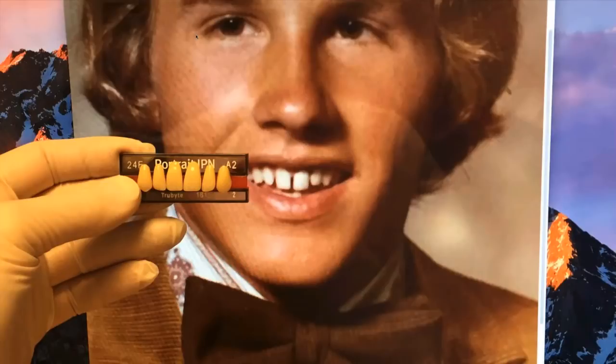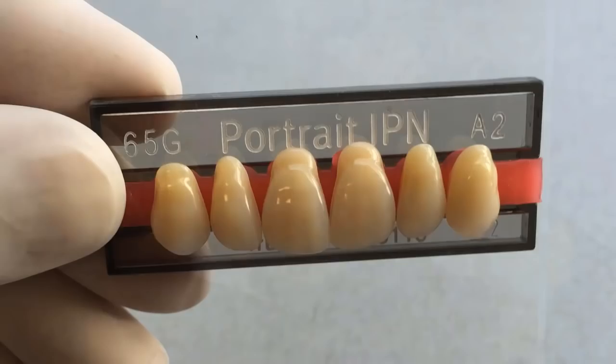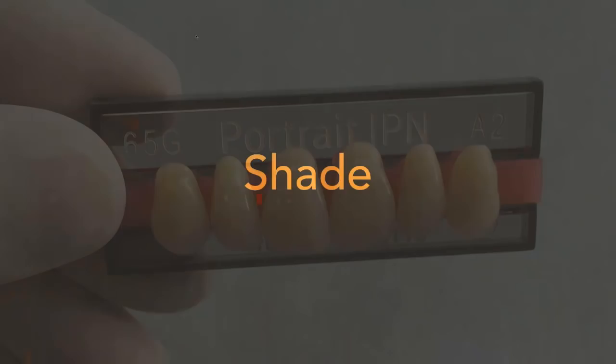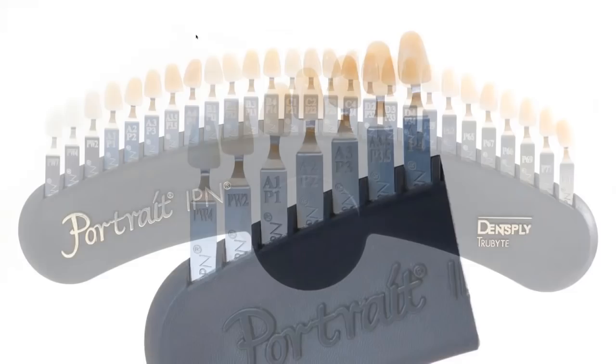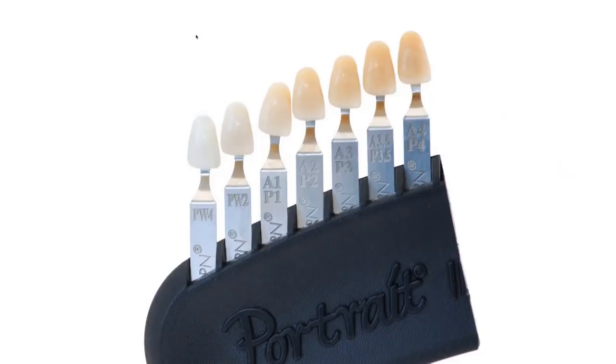Select teeth the way you'd like to, but I think this photo technique works pretty well. For shade: since this is a simplified technique, I don't use a full range of shades for dentures. I've cut my shade guide down to about seven different shades, including a couple of power whites. I use the A shades and simply give it to the patient and ask them to select the tooth color they want. Usually they'll pick A1, power white, maybe A2, rarely A3, certainly not A4. What I've found is that patients never complain about shade — they selected it, they're happy with it, they're proud of it.